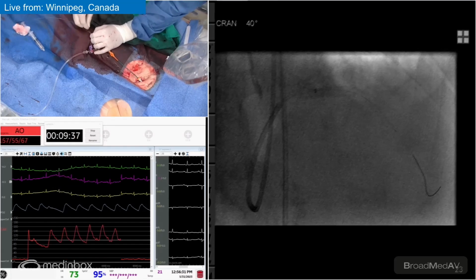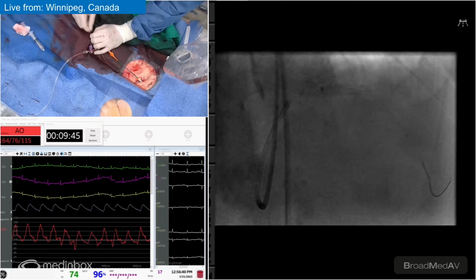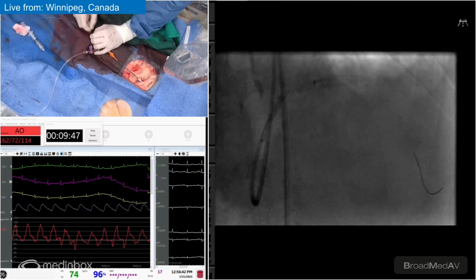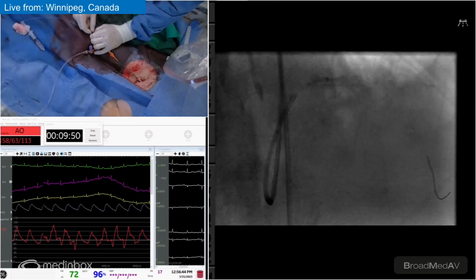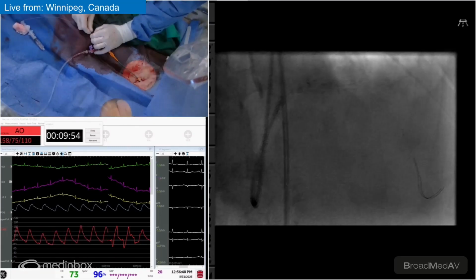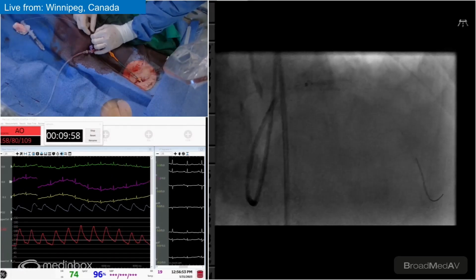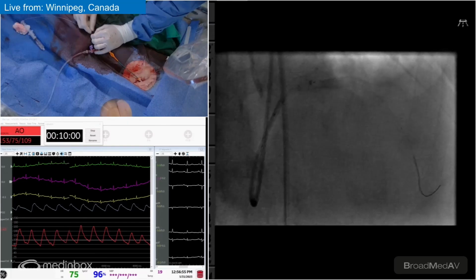Yeah, it looks fairly nice and comfortable going in. I think it was because of this RX point, it was actually rubbing in the guide as it was going up. It's a hard time going in. I think that angulation is not helping it. Let's see if I can get the guideliner a bit deeper.